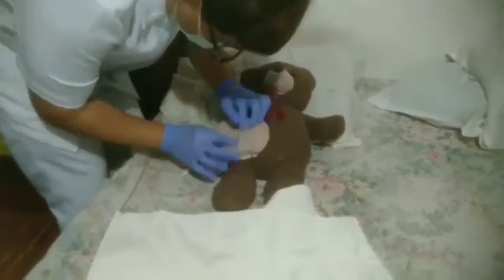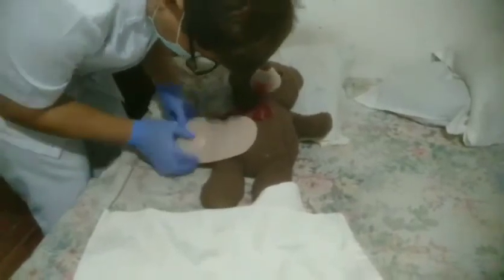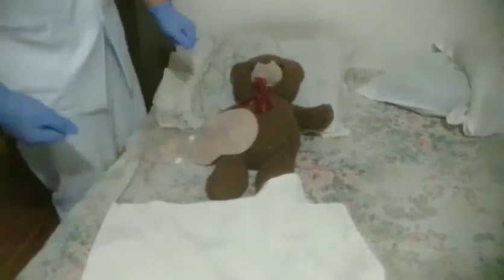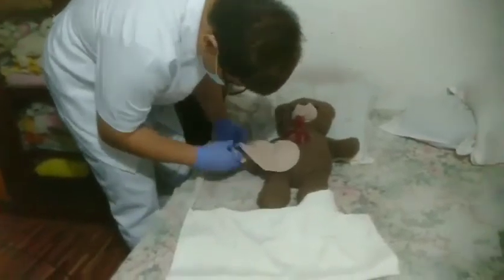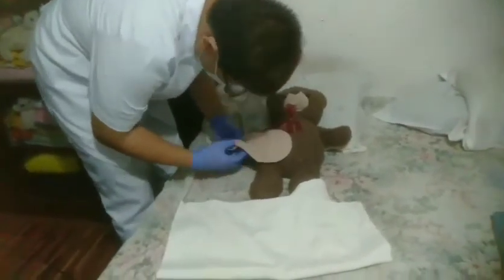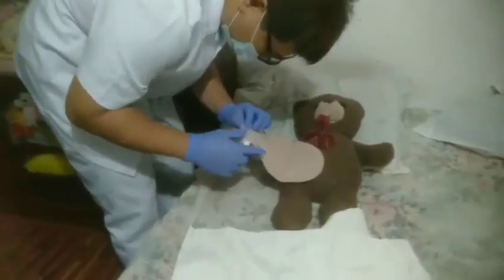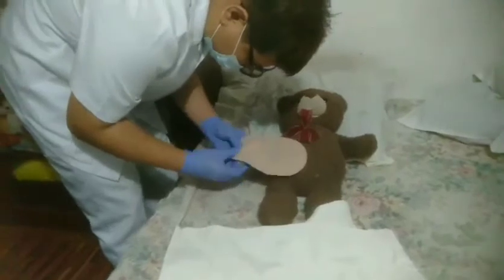Center the opening of the pouch over the client's stoma and apply it directly onto the skin barrier. Gently press the adhesive backing onto the skin and smooth out any wrinkles, working from the stoma outward. Remove the air from the pouch. Place a deodorant on the pouch, optional. This is optional only. And then you can close the pouch by turning up the bottom a few times, then holding it lengthwise and securing it with the tail clamp closure, which is placed in the bag.